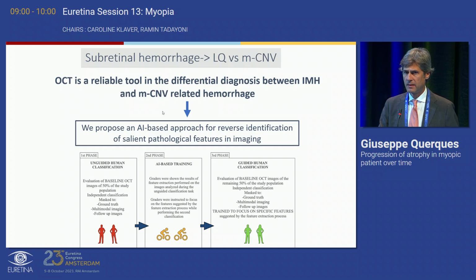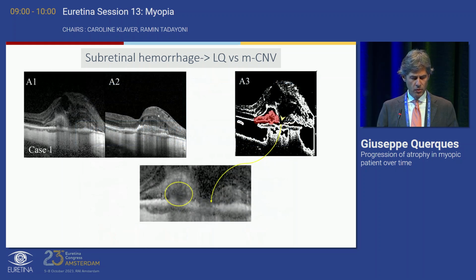Then we applied a quite complicated analysis with artificial intelligence to further demonstrate that the binary sign is trustable. I will go quickly through the results, without including our definition of the binary sign and the artificial intelligence.